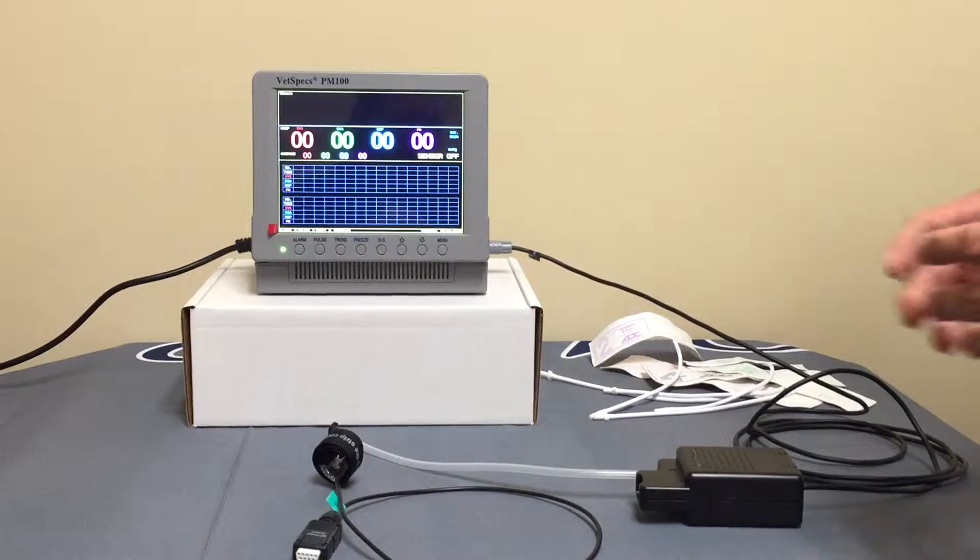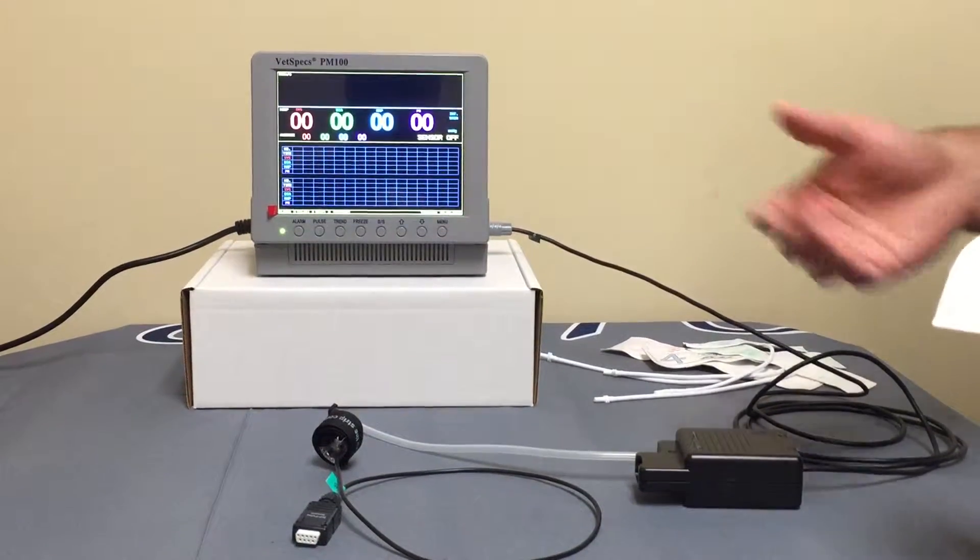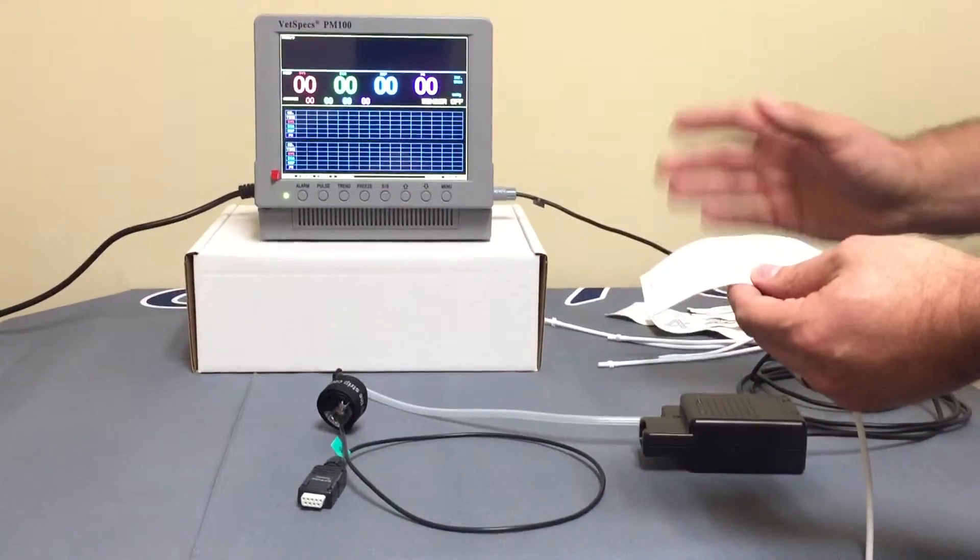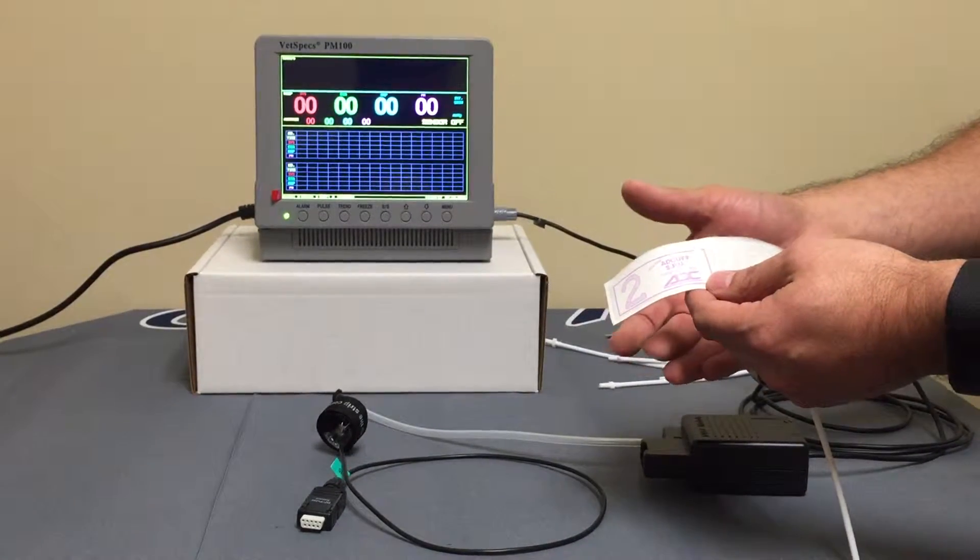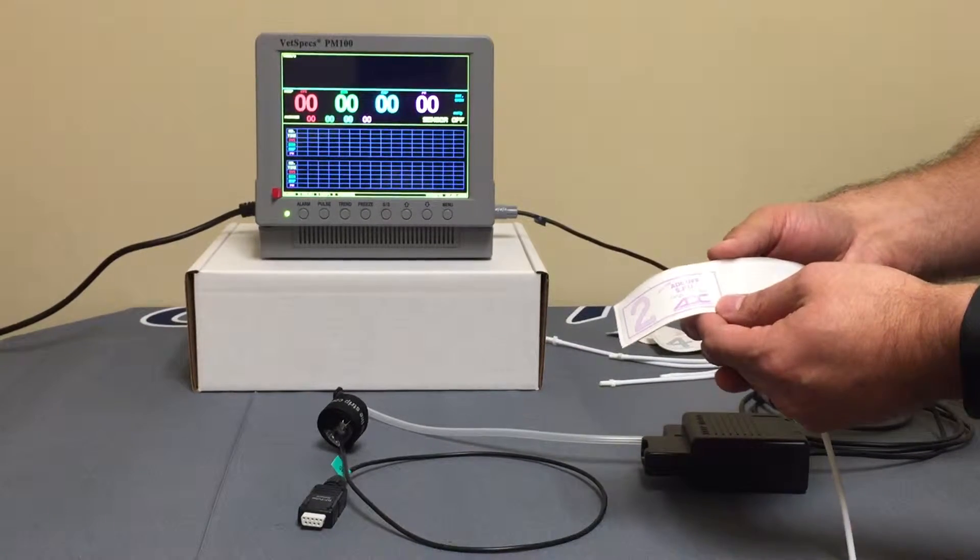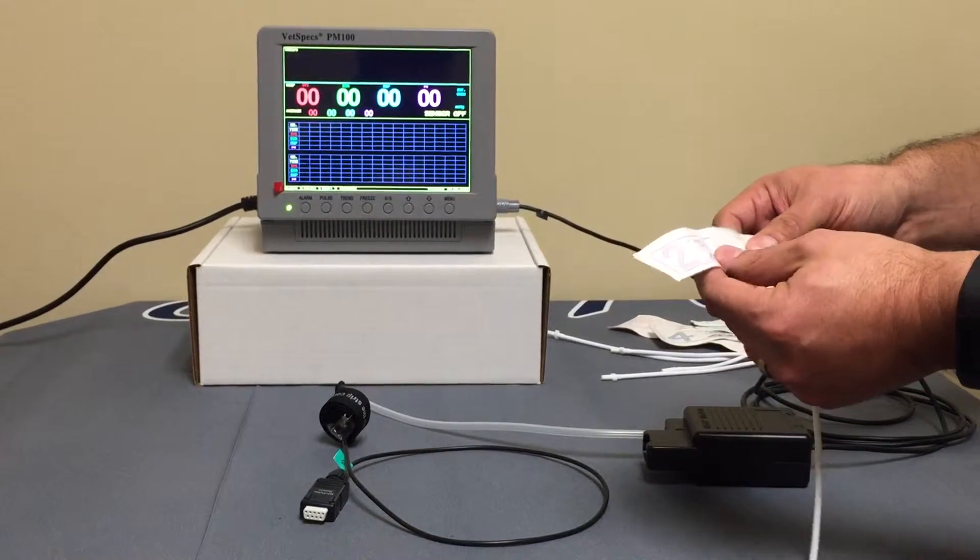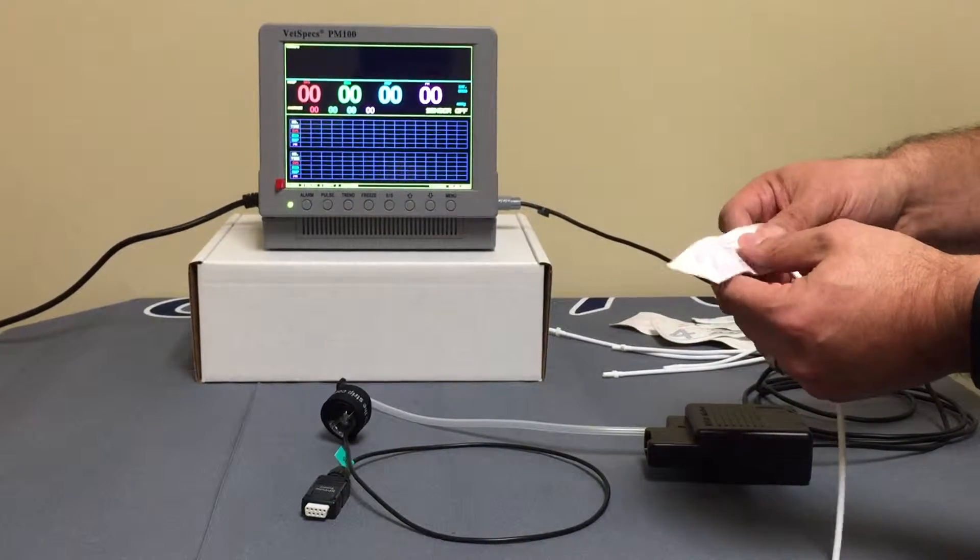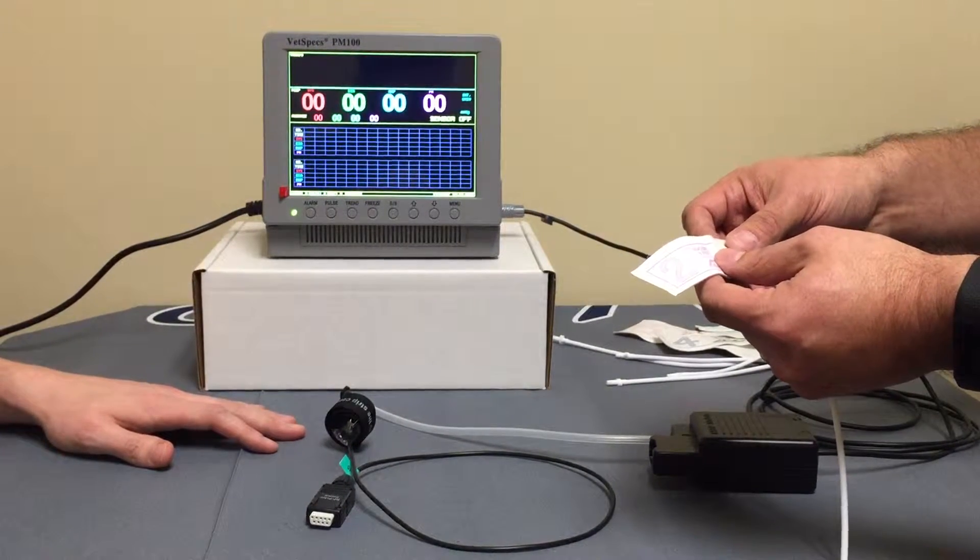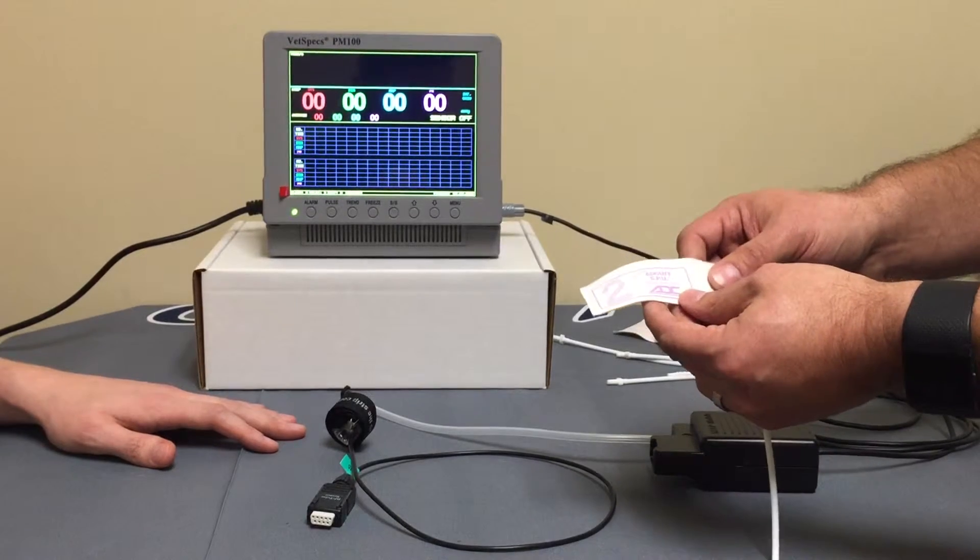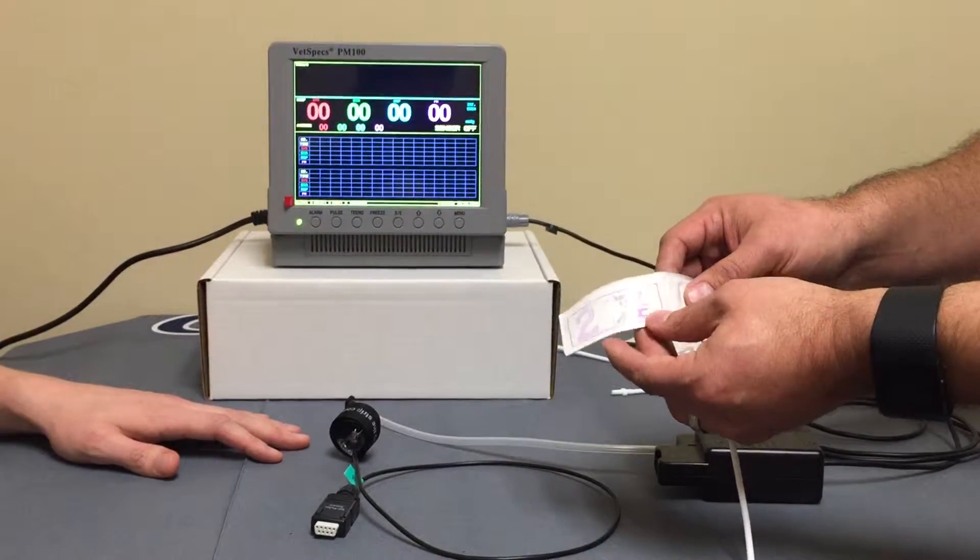I had mentioned earlier as well that VetSpecs provides six different sizes of occlusion cuff. It's really important to make sure that when you choose a cuff, you're providing an occlusion cuff that is proper for the size of the limb that you're going to attach to. So in this case, I've asked my colleague to join me here since we don't have a cat or dog here in the office. We're just going to hook up to his finger and that'll work just as well. I've chosen a number two cuff.